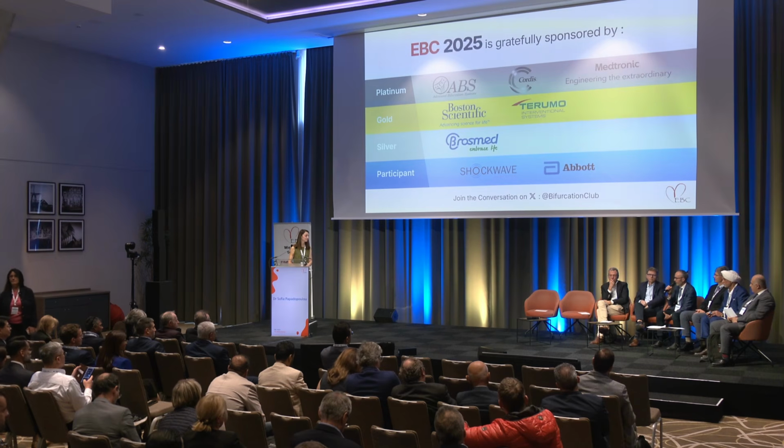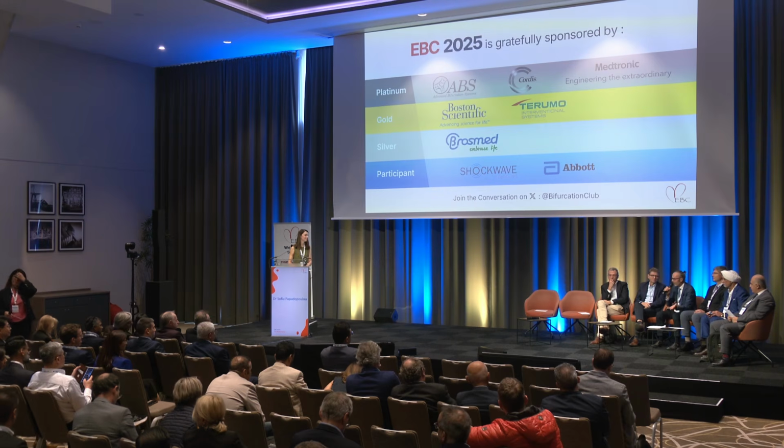Obviously, we've got the DCB BIF study, which excluded them. Yes, there is no penalty to use the DCB. If the cost of the balloon doesn't increase the budget, I think it can be used. There is no penalty. And the second question was another one.